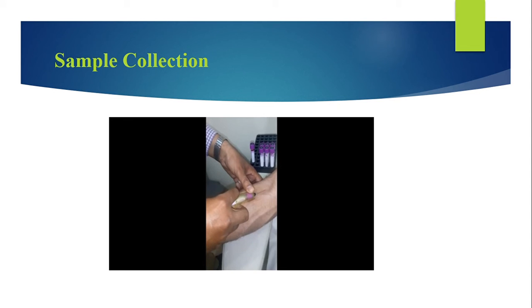So there are two methods of preparation of PRP, the PRP method or the Buffy coat method. We will be talking about the PRP method, which involves centrifugation at two different speeds. So after the blood is collected, about 20 cc of blood is collected in vials containing anticoagulant so as not to clot the blood immediately at the collection.